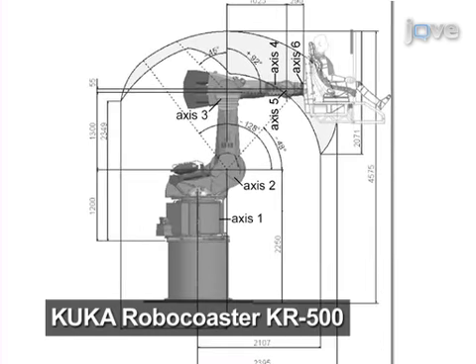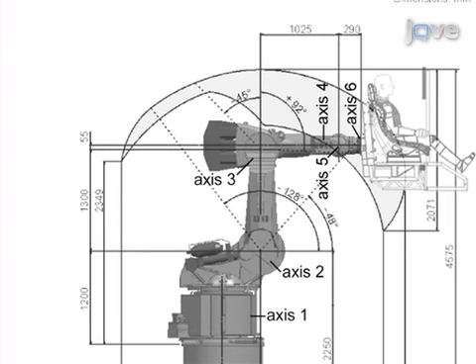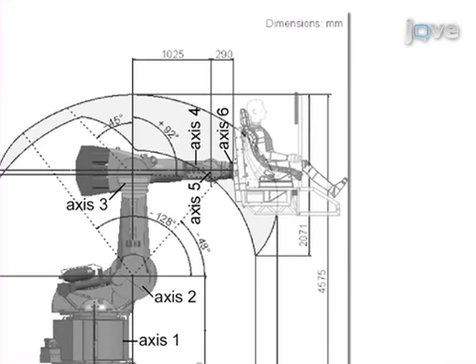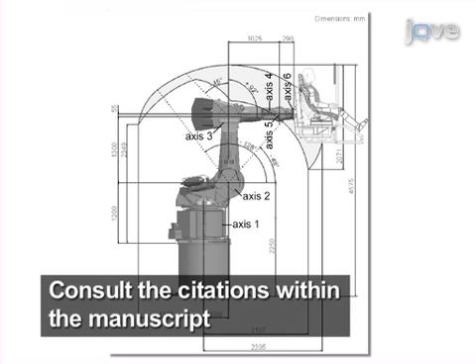The MPI Cyber Motion Simulator consists of a 6-joint serial robot in a 3-2-1 configuration. It is based on an industrial robot with a 500-kilogram payload. To make the robot safe for experimentation, modifications were made both to the hardware and software.